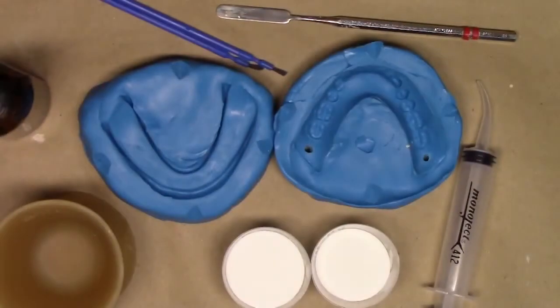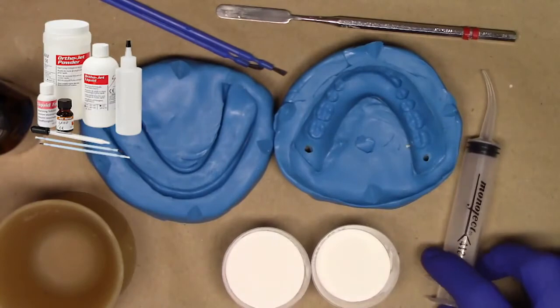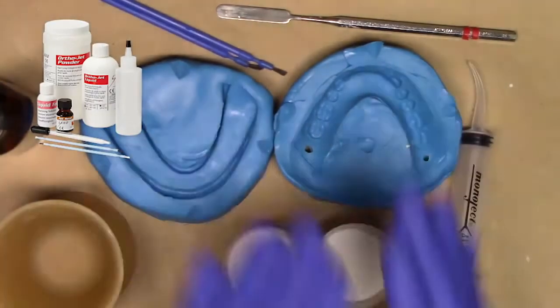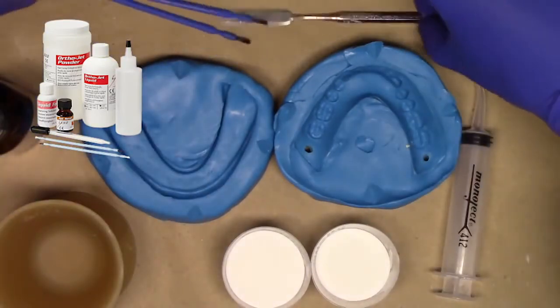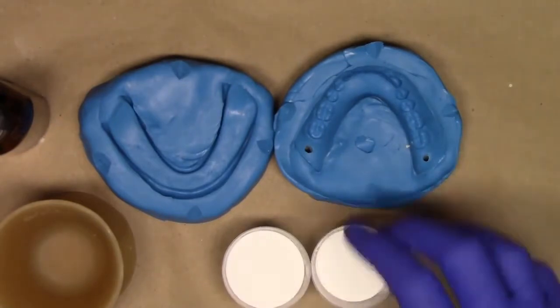Now we're at the laboratory portion of the fabrication of the surgical guide. The patient has been dismissed and their denture has been returned to them. What we're going to do is utilize what I mentioned before, the clear orthodontic resin, monomer, some mixing devices, as well as an injection type of monoject syringe. Our putty duplicate is right in front of us. We're going to go ahead and separate our materials just a little bit and prepare what we need to do.